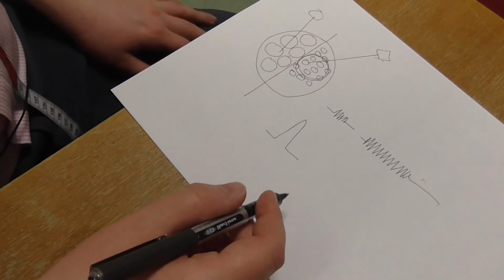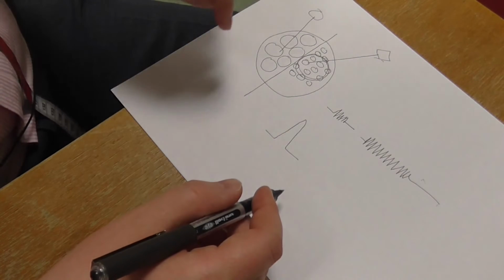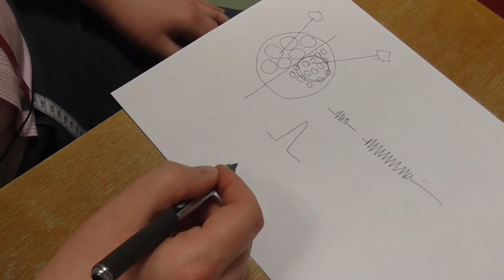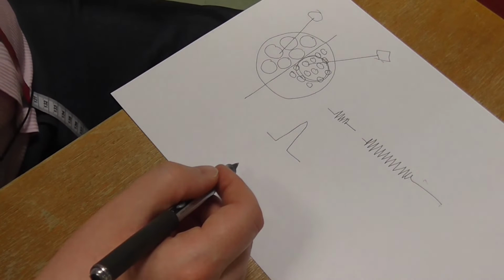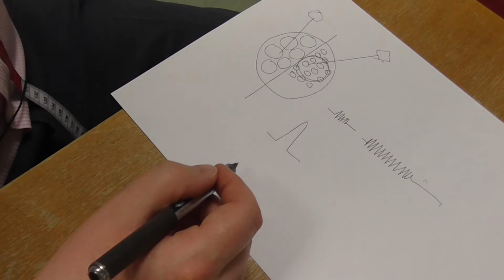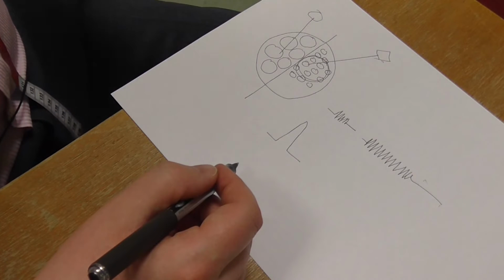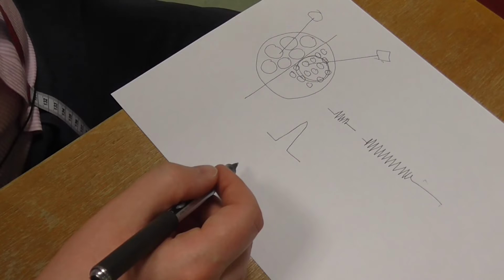The other thing with myopathies that we're looking for is what happens when we're sticking the needle in. Is there irritation of the muscle membrane? And we can pick this up in a number of ways, and we can see fibrillations, positive sharp waves, complex repetitive discharges, and these are all features of myopathy. In some of the more chronic myopathies, we can also see what's known as muscle fibre splitting, and here we will start seeing some neurogenic changes present as well.